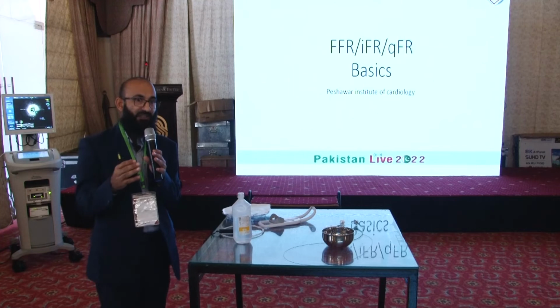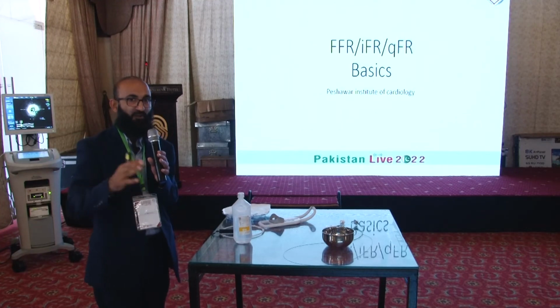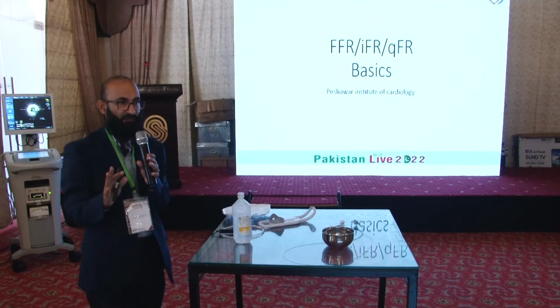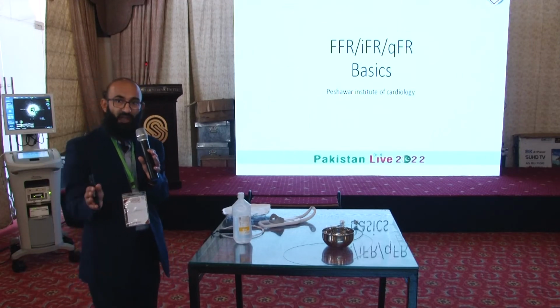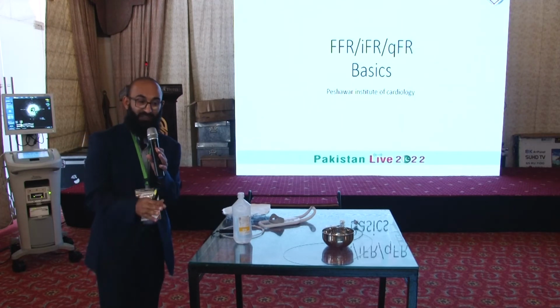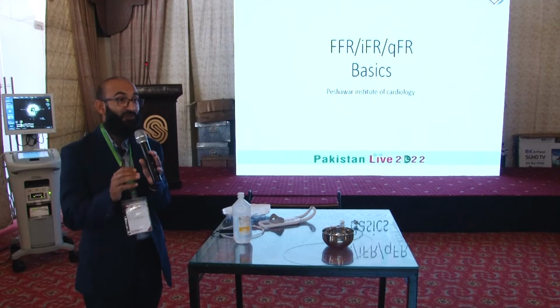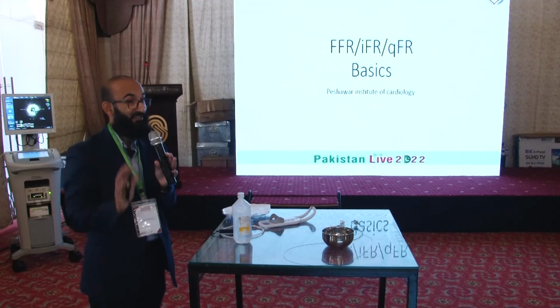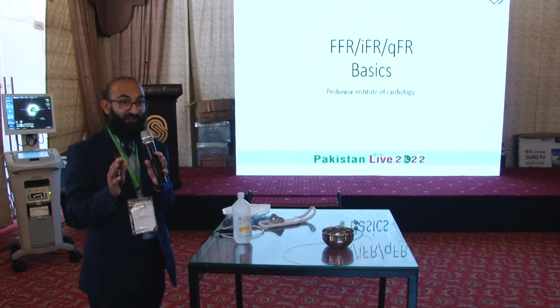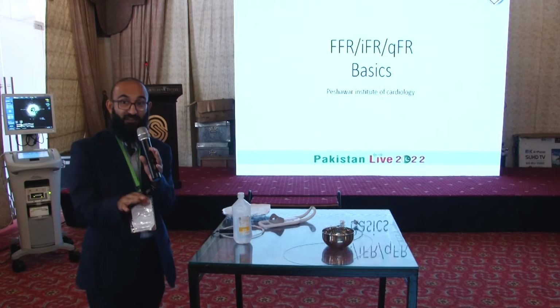All these are validated, tested, and have a key role. There is a lot of data on it. It's proven benefit. So that's why we have to incorporate physiology. And mind you, I will show you one very interesting case. Sometimes it's so valuable that you can avoid putting in a stent. That's very key to a stable plaque, which is non-ischemic. So it has a key role.